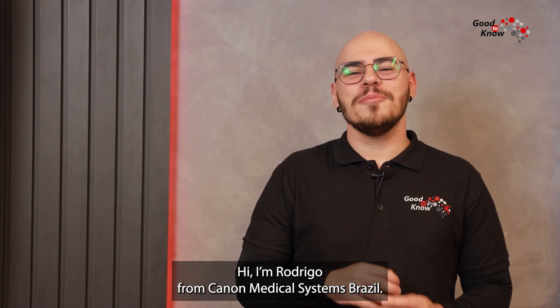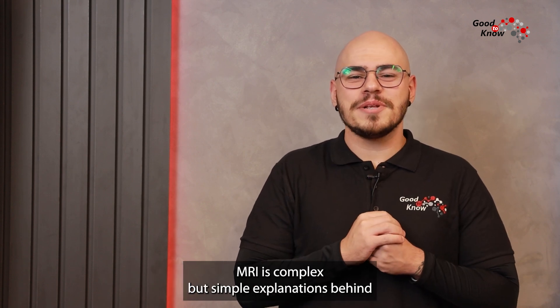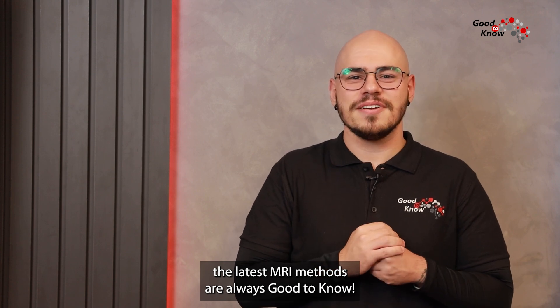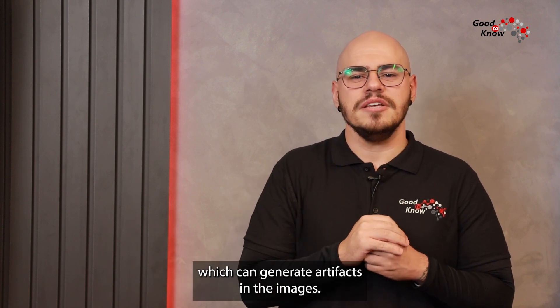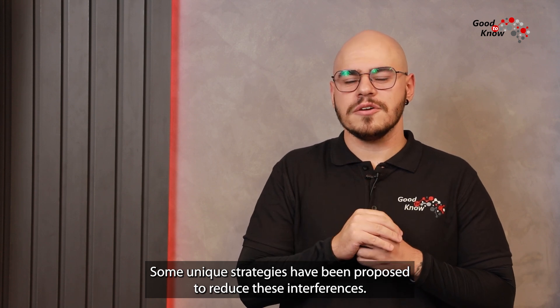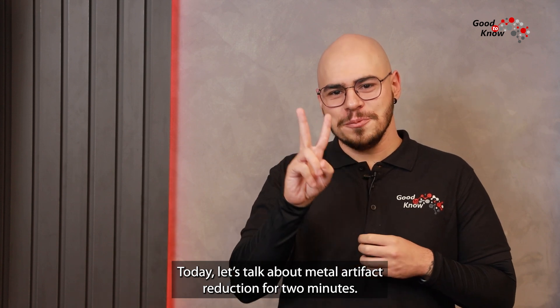Hi, I'm Rodrigo from Canon Medical Systems, Brazil. MRI is complex, but simple explanations behind the latest MRI methods are always good to know. Sometimes in MRI we encounter patients with metallic implants which can generate artifacts in the images. Some unique strategies have been proposed to reduce these interferences. Today let's talk about metal artifact reduction for two minutes.